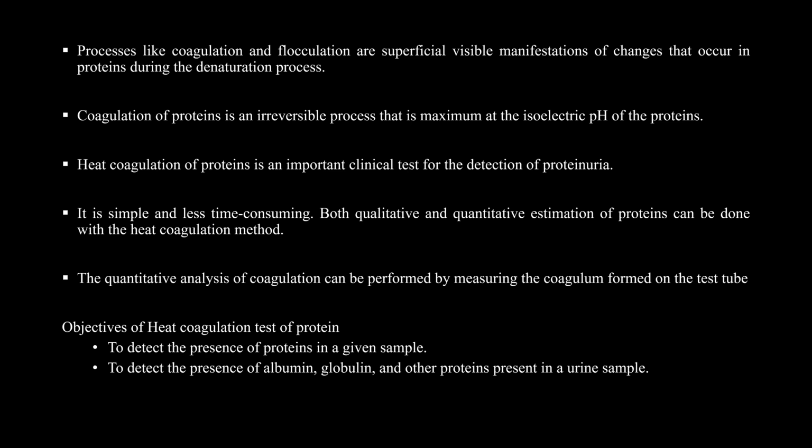Quantitative analysis of coagulation: perform the measurement of coagulum formed in the tube. The heat coagulation test detects protein in the sample, the presence of albumin, globulin and protein in the urine sample.